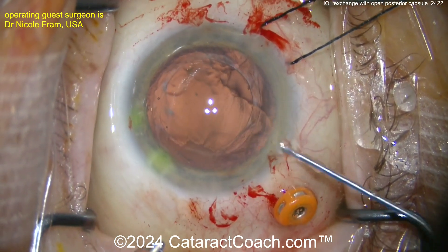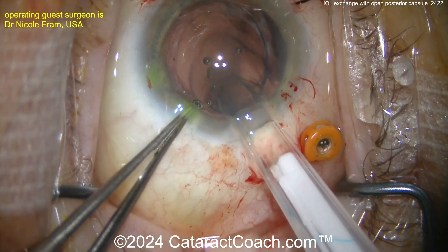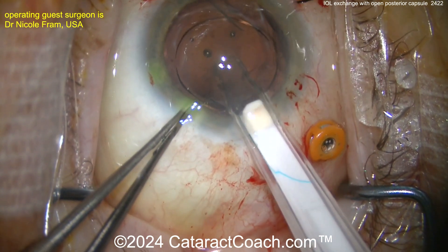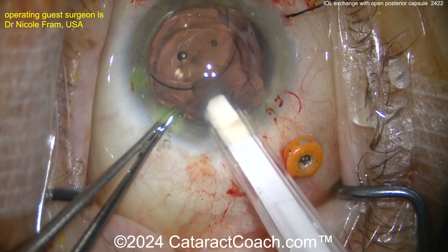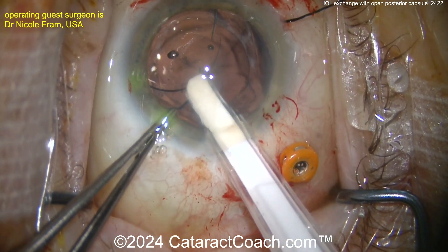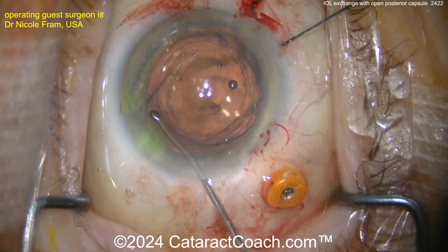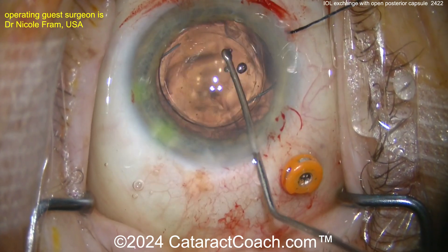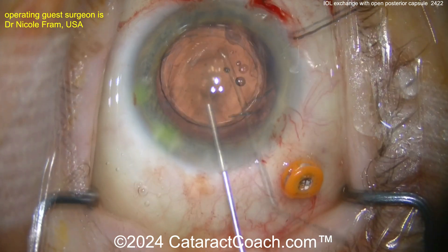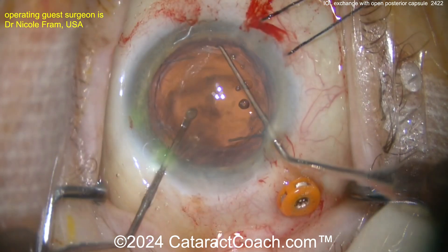When you have a pars plana port put in, remember — like a retina specialist does — you have to check for entry site breaks. Now here comes a three-piece lens; it's a silicone lens. The haptics go in the sulcus, and then the optic is going to go into the rhexis — optic capture through the anterior or posterior capsule rhexis. More viscoelastic, and it's a nice outcome.